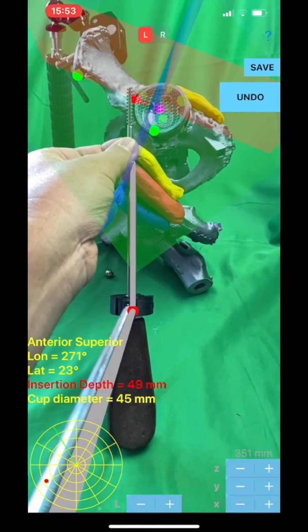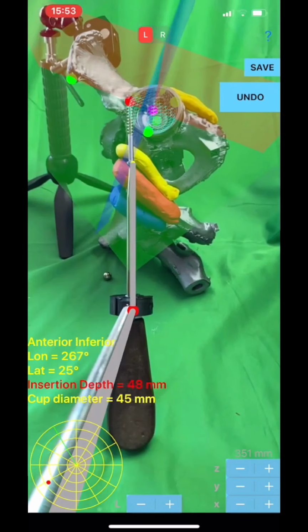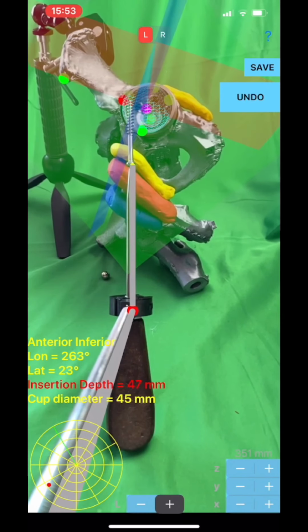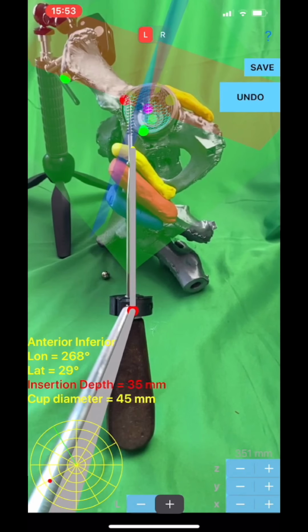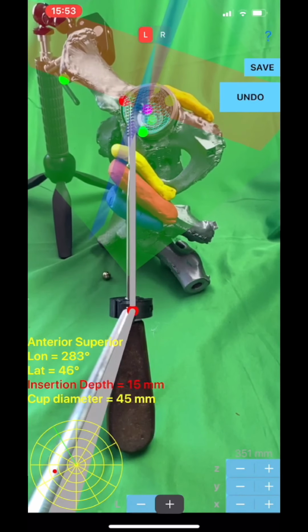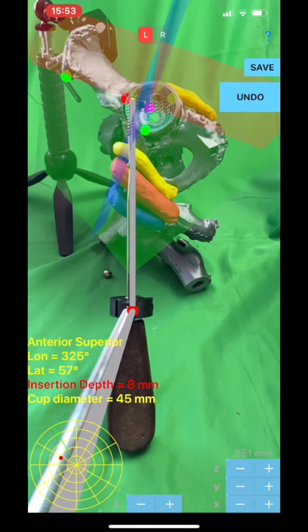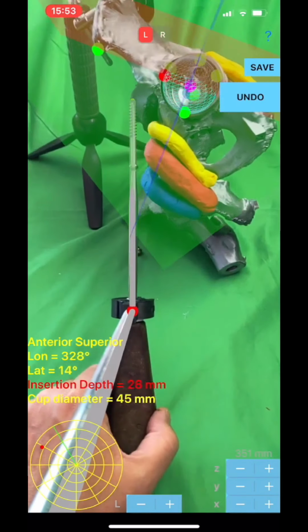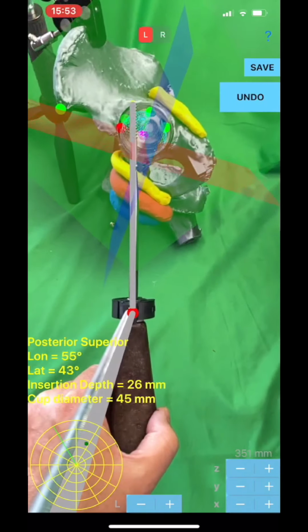By pressing the Go button, the surgeon can view a gray cylinder projecting from the red sphere at the clamp to a yellow sphere superimposed in AR over the shaft of the real tool. The length of the gray cylinder presented in AR must end at the tip of the screw. The length of the gray cylinder, which ends at the yellow sphere, can be adjusted by pressing the plus or minus button over the screen in the same way, and must coincide with the tip of the real screw in order to be calibrated and work properly.